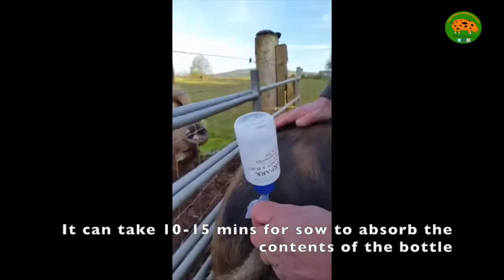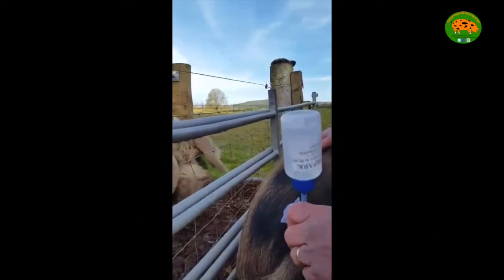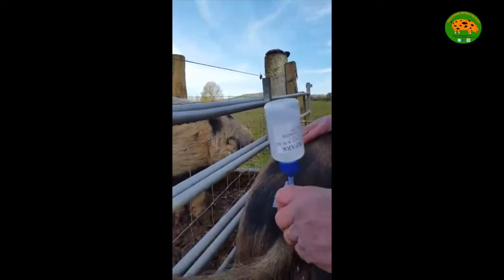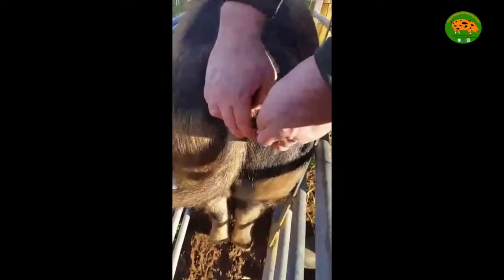As you can see, this boar's looking quite keen — he's getting some grunts going, and it's apparently the grunting and the smell of the boar that encourages the sow. Keep those grunting sounds going, you're doing a good job. So let me just tie that off.